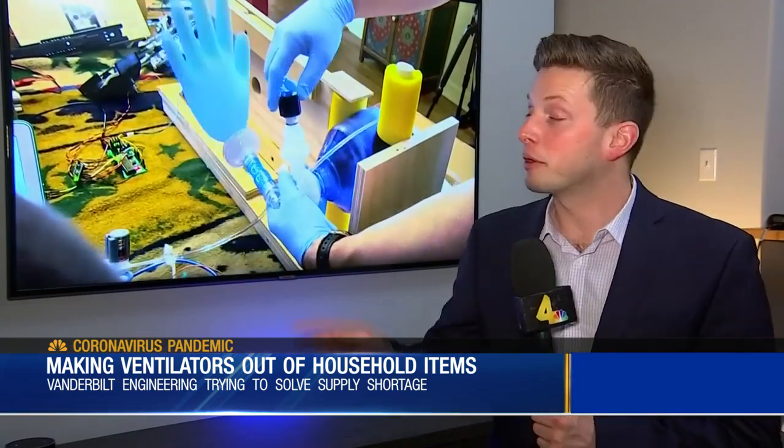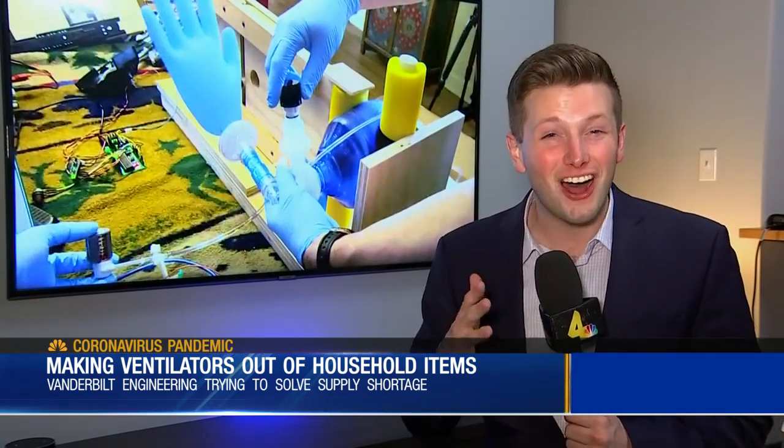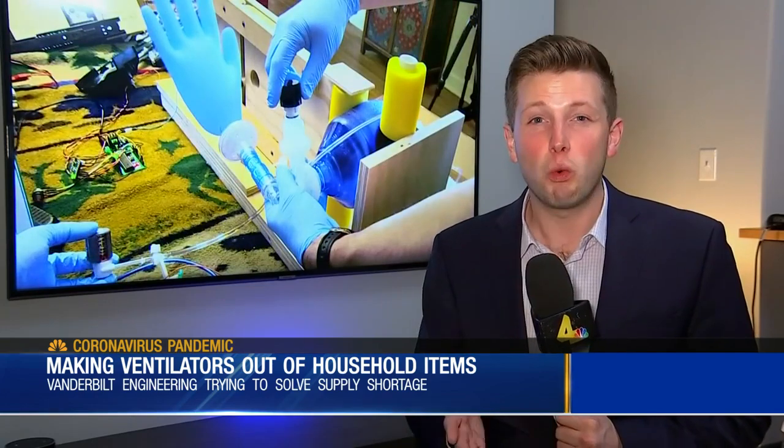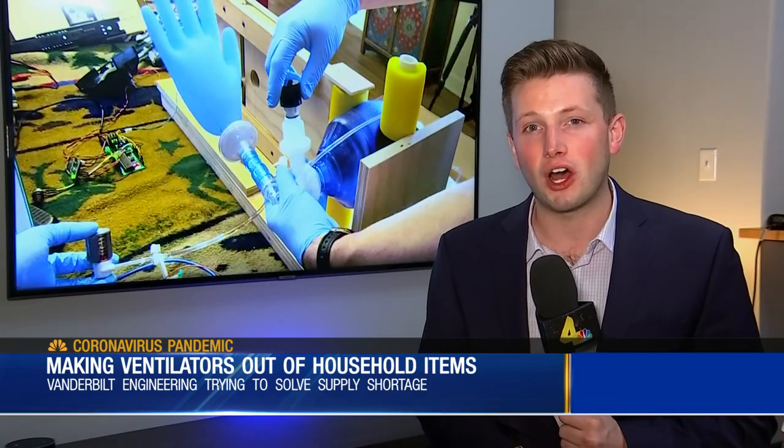And we want to be ready when that time comes. They tell me that they will perfect this third prototype and then they'll show it to the doctors for approval. They say then they'll start making more of them. They're hoping to make about a hundred, and each one of them will cost just less than a hundred dollars to make. After that, they'll put the CAD drawings online, make it available everywhere. In Nashville, Ryan Breslin, News 4.